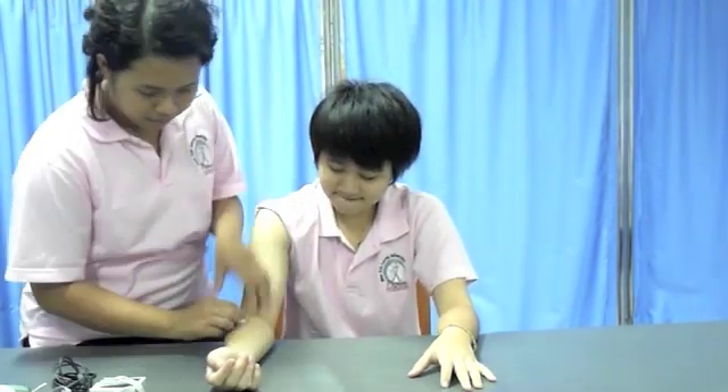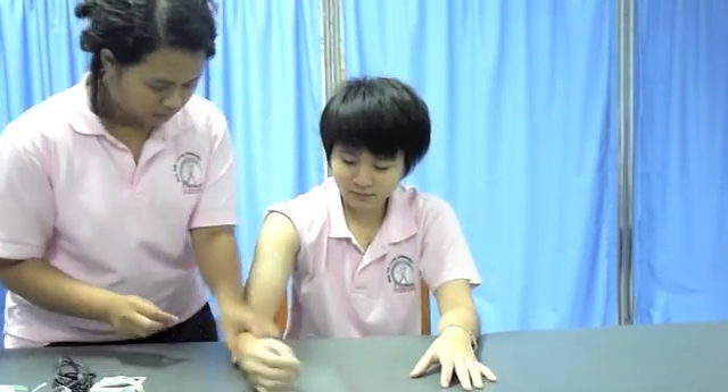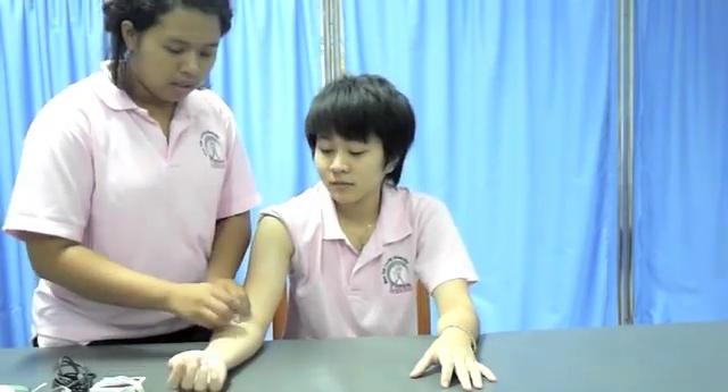Before I use the Functional Electrical Stimulation, I will clean your skin with alcohol to reduce the resistance. I will clean the extensor group of the forearm, then the flexor group of the forearm, and lastly the bicep.